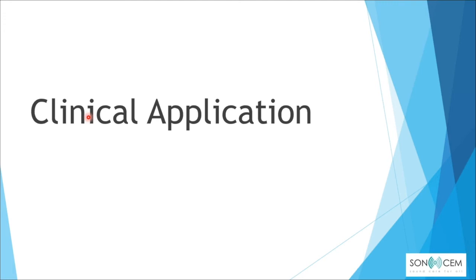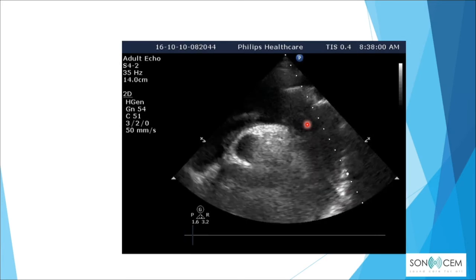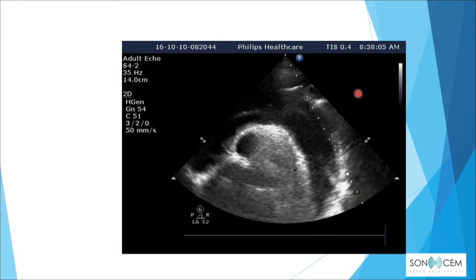For clinical application of the thoracic aorta, using the suprasternal notch view, we can grossly see a dilated aortic arch of more than 4 centimeters, and a bright line representing an intimal flap. On the video clip, the flap can be seen moving within the aortic arch.